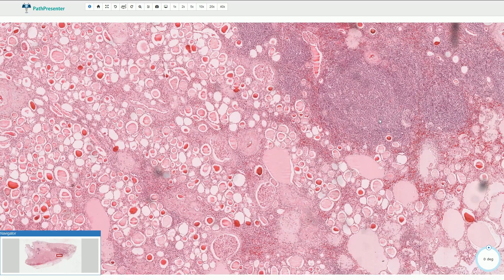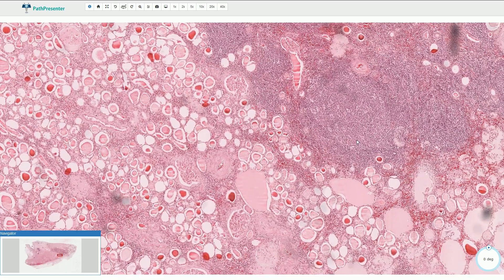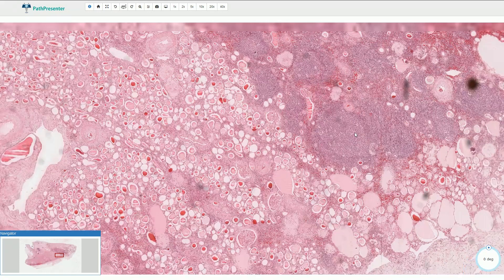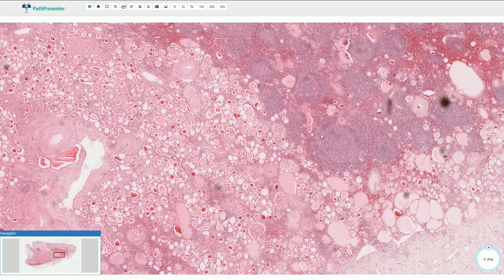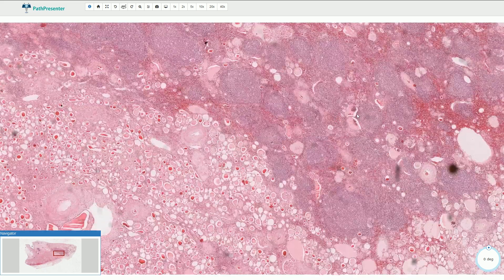Here we see prominent chronic inflammation composed of lymphocytes, and here we even see the formation of follicles with activated germinal centers.